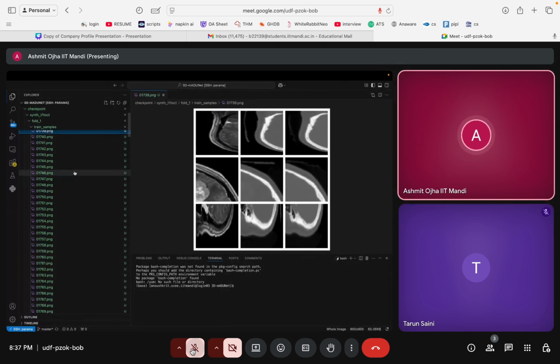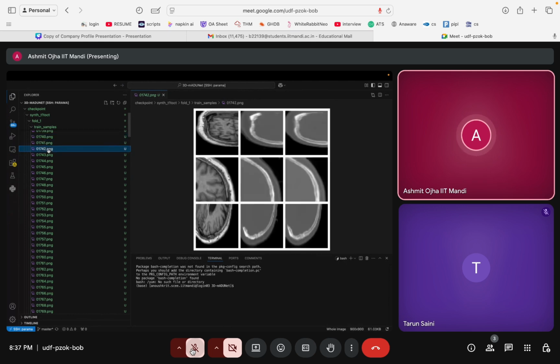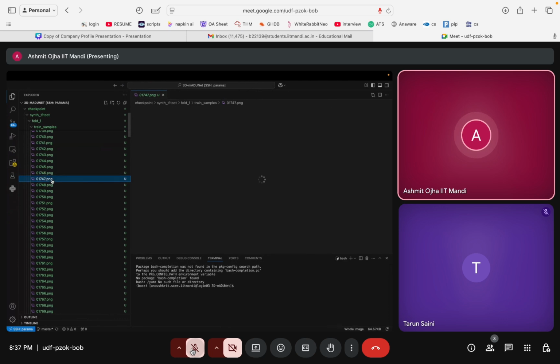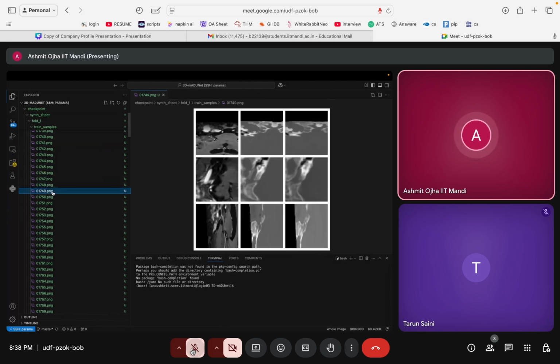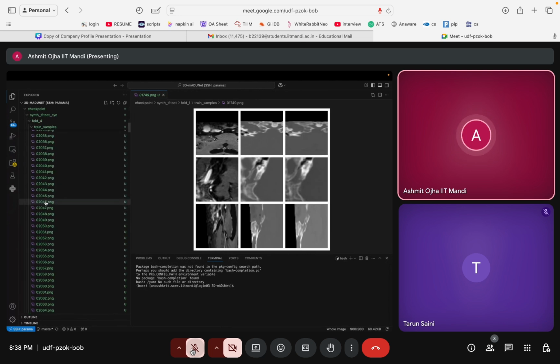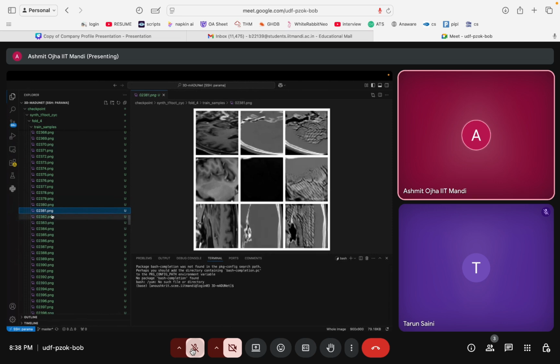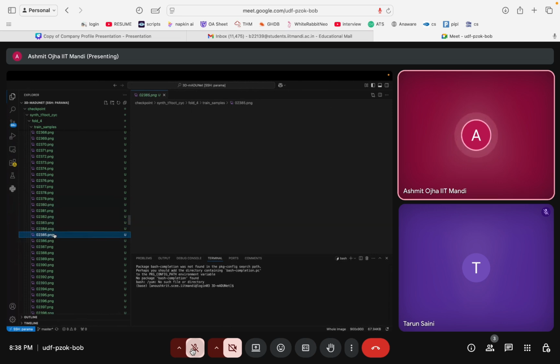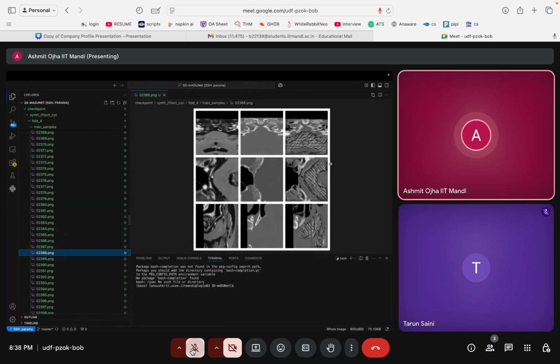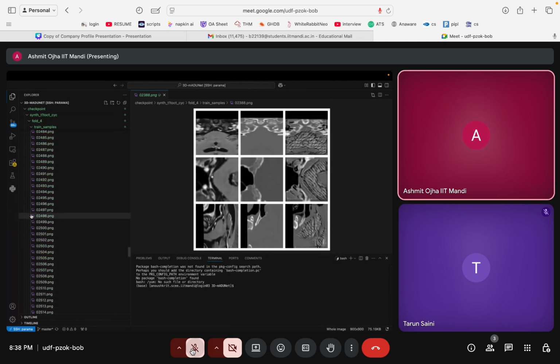So these were the inferences that we performed using our model. For instance, these were the results generated during training itself by validation, and these are the results generated by 3D MAD-UNet, pure vanilla 3D MAD-UNet. Then when we extend it for CycleGAN style training, after training it for a good amount of time, we start to see these artifacts and hallucinations, and the results have all of these messy artifacts in the CT scans, which should not be there.